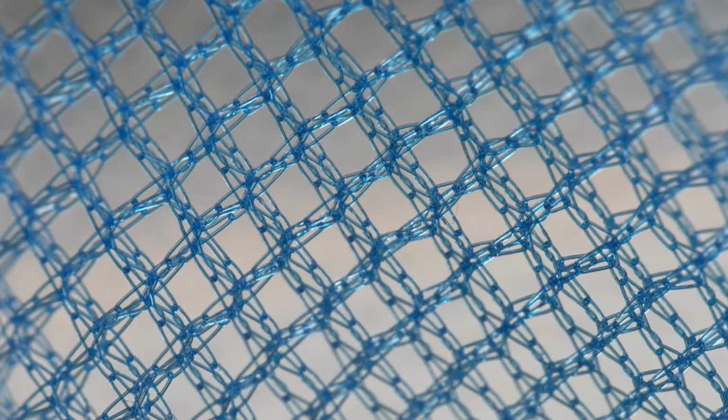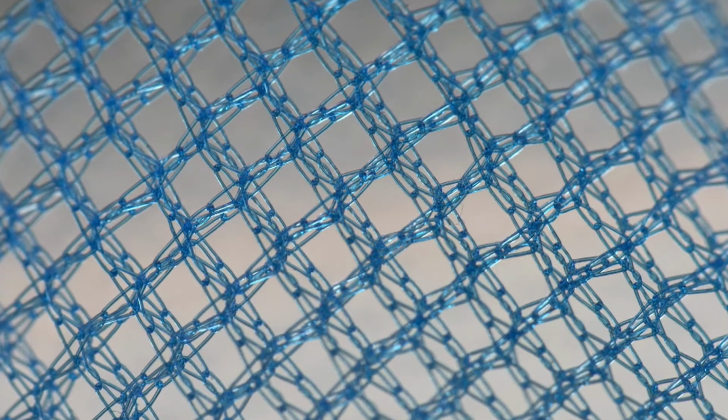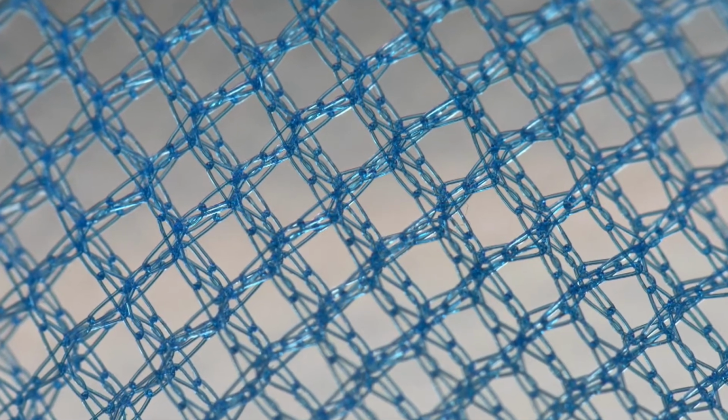Now, the sling itself is a mesh. So what is a mesh? Well, you could think of it as a screen on a window where you have material, and in this case it would just be a permanent suture, and they're cross-linked together. It's very small, somewhere around 5-6 centimeters in length, and essentially it forms a scaffolding or a hammock, if you will, below the urethra.